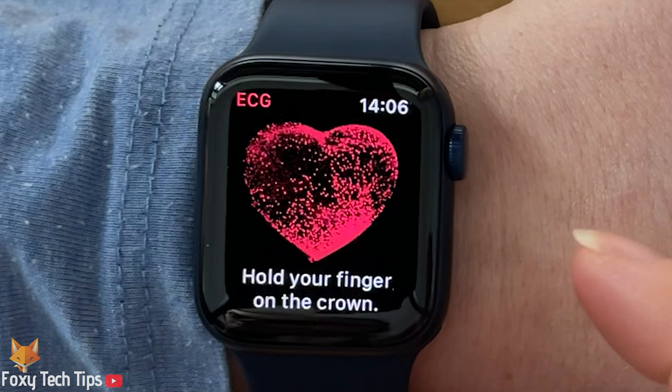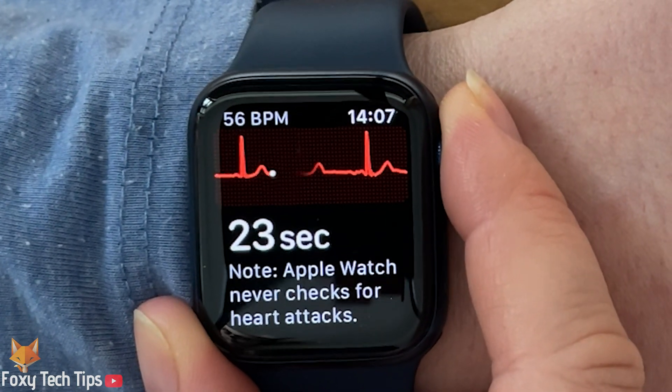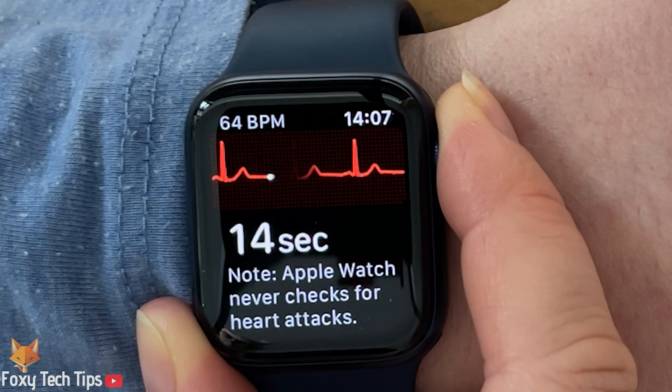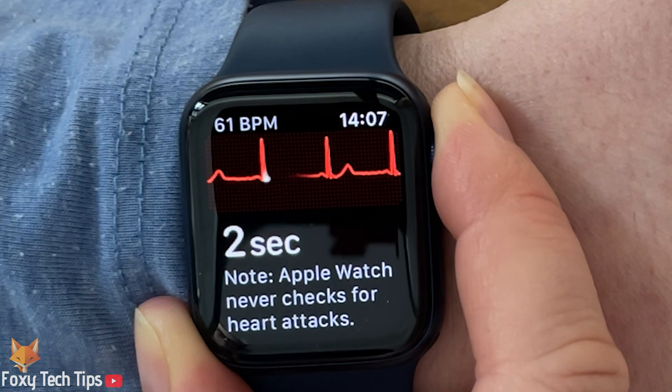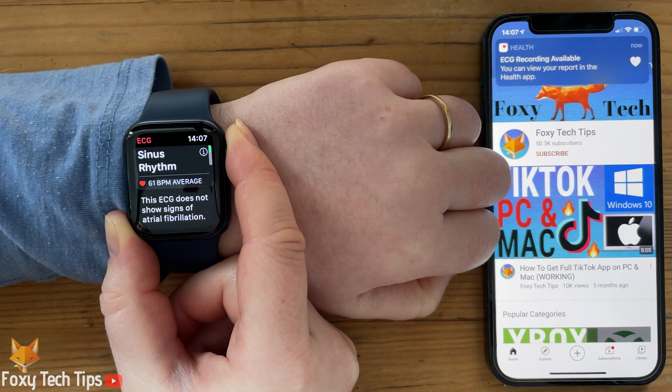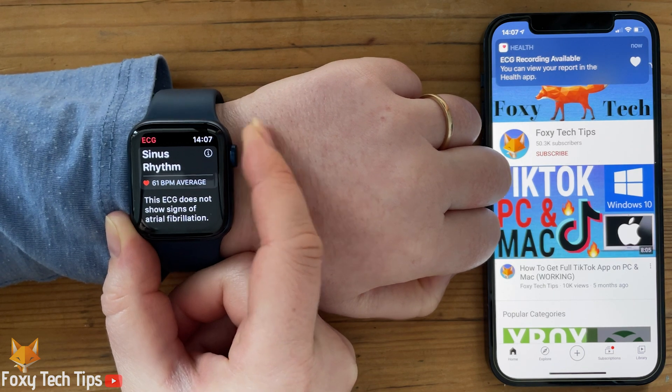Launch the app and start the ECG reading by holding your finger on the digital crown. It takes 30 seconds to get a reading, so try not to move in this time. Once it's finished, you will be presented with the results. You can tap the eye for more information.